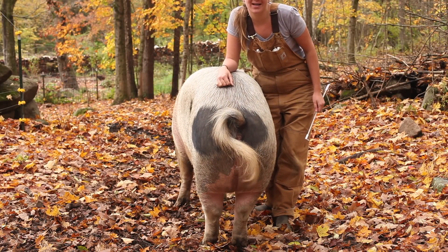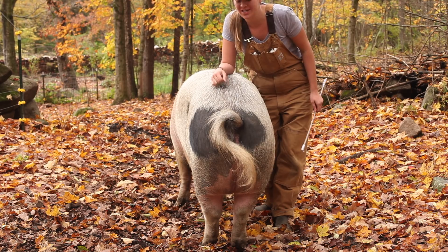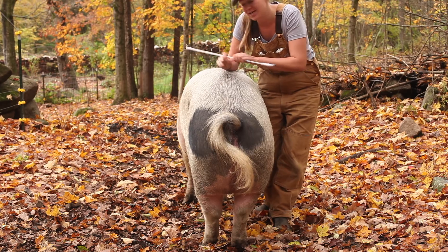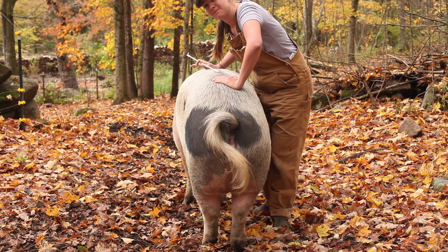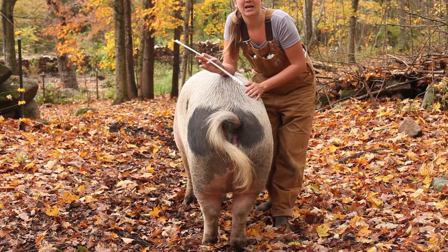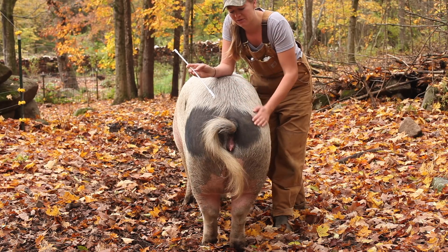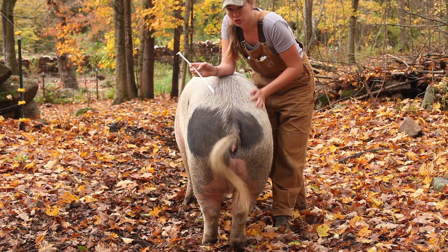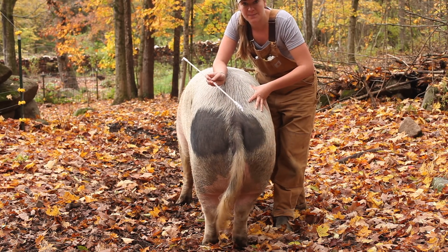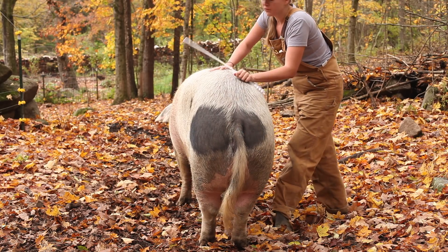Hey guys, welcome to my second video on artificial insemination. Right now we are going to do the actual inseminating portion. As you can see, Big Marie is in full standing heat. She is completely locked in. I gave her a spray of the boar scent and that has really been a lifesaver and has helped trigger her standing cycle and really make her lock in tight and make it easier for me to inseminate her.